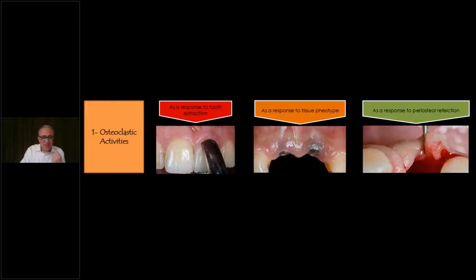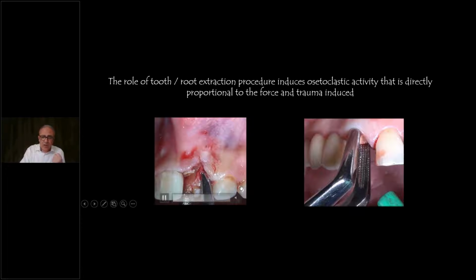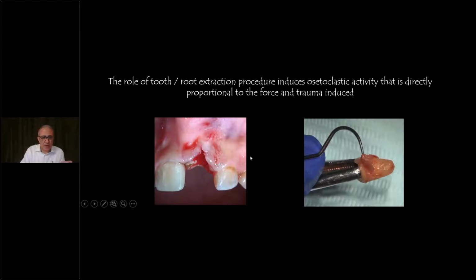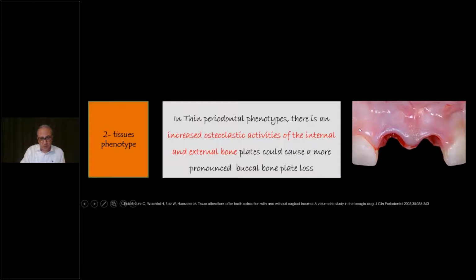As you can see here, it starts with aggressive extraction. You can lose the soft tissue, or you can lose the bone with taking the tooth out. Just very simply and very easily, you can lose the bone or you can lose the soft tissue. That indicates how delicate the procedure is in order to get a good prognosis. And when we say good prognosis or a good outcome, it means a long-term one, not just a nice-looking case that looks good in 45 minutes. No, we're talking about 1 year minimum or 2 years.